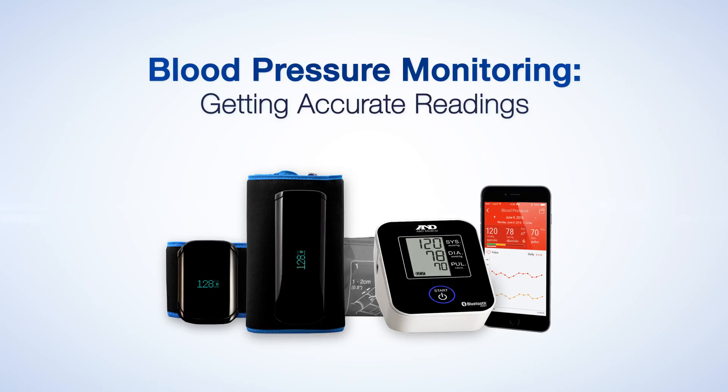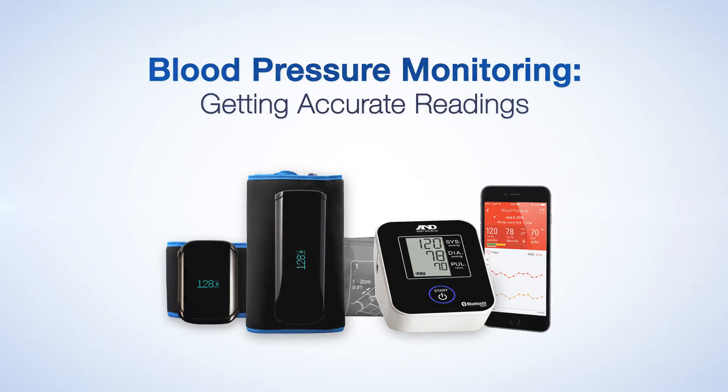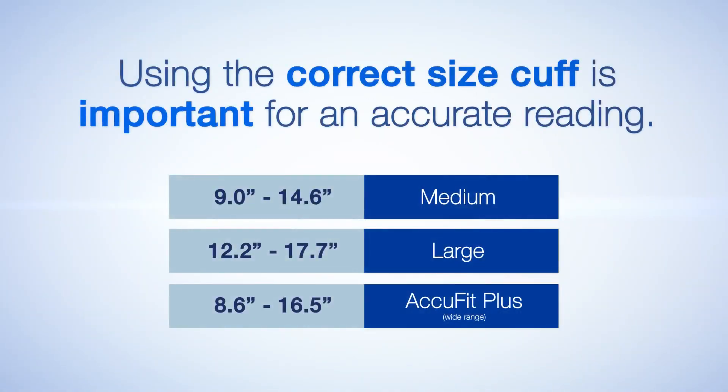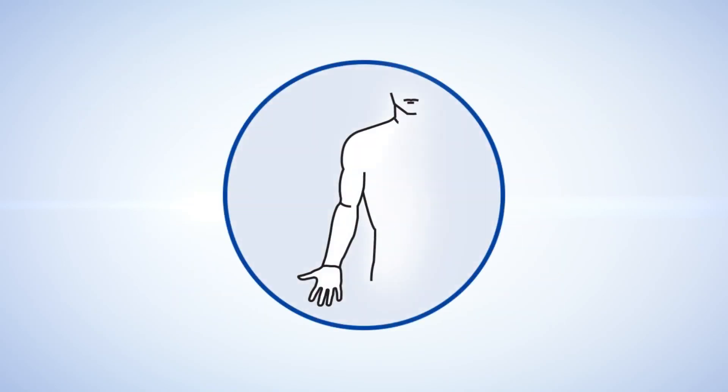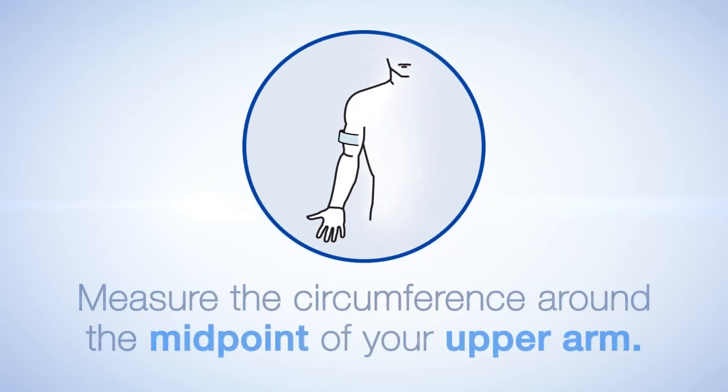A&D Medical's blood pressure monitors are clinically validated to provide dependable results. Using the correct cuff size is important for an accurate reading. To determine what cuff size is appropriate for you, measure the circumference around the midpoint of your upper arm.